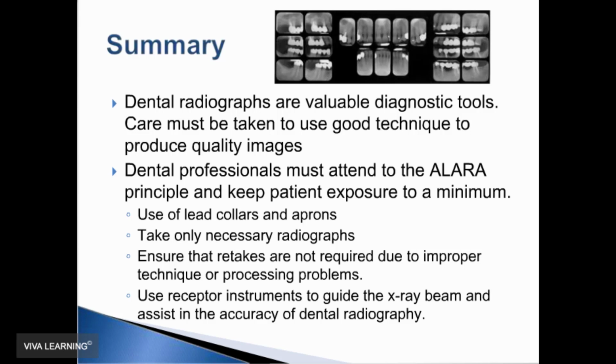There is a question about the best phosphor plate system to be used with a particular software package. It would likely be best to consult your representative about what system works best with their software or what can be interfaced with that. That's a particular product-specific question. I would have to do a follow-up on that to give you a precise answer, but your representative should be able to help you with that.